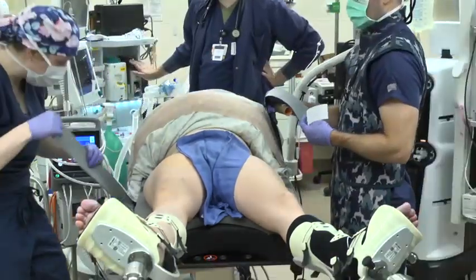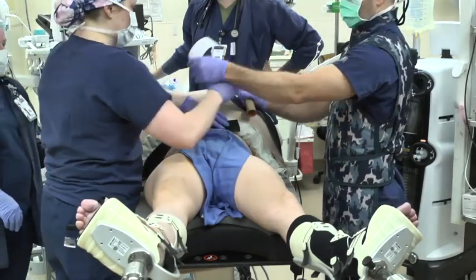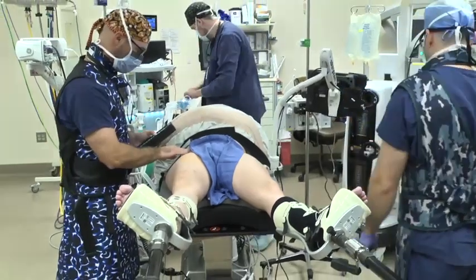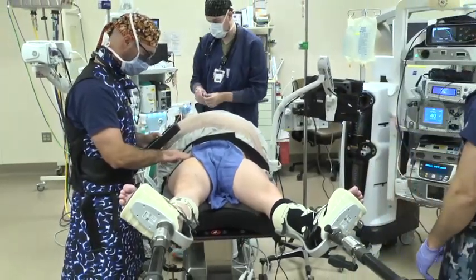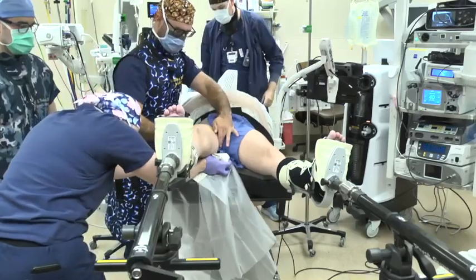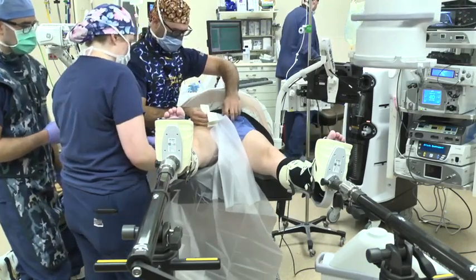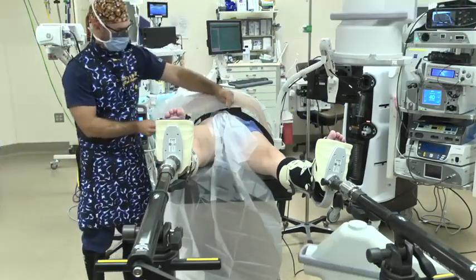Safety straps are then applied. The iliac crest is then palpated to ensure that the operative site is still exposed. The height of the bed is then set to the surgeon's preference. To protect the equipment, the operative extremity is draped with a 10-15 drape under the leg and a 10-10 drape proximal to the iliac crest.